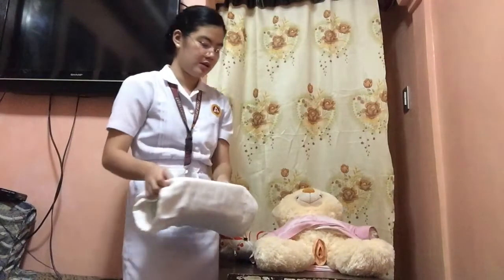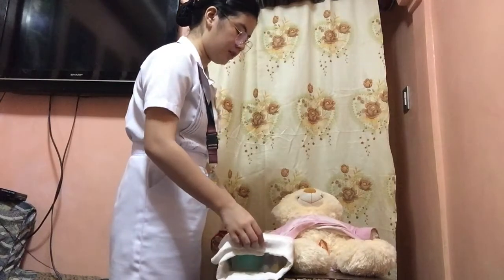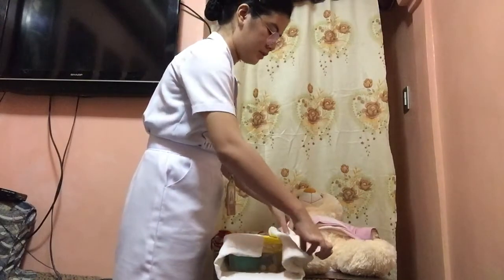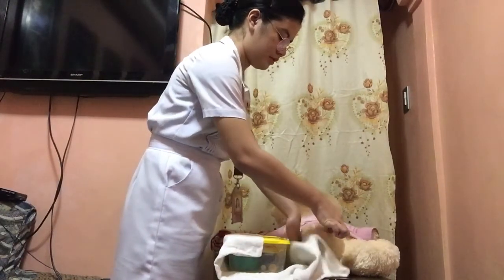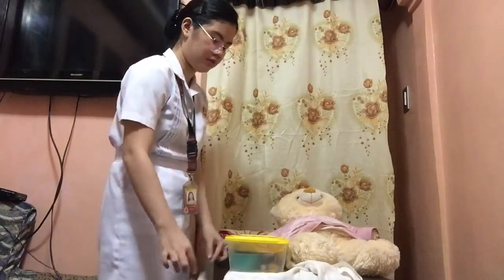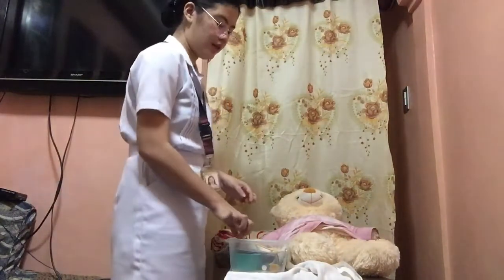Open the sterile catheterization tray on a clean over-bed table at the tail of the bed using sterile technique. Since our hands are considered clean, we will only be touching by the edges. And then put on the sterile gloves.